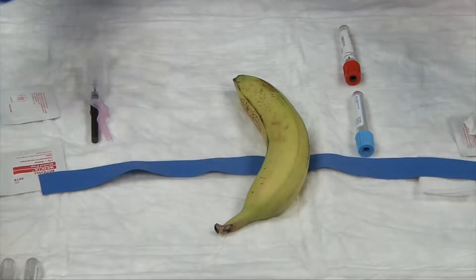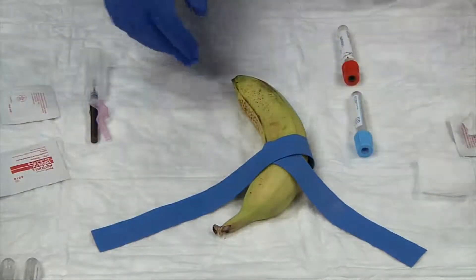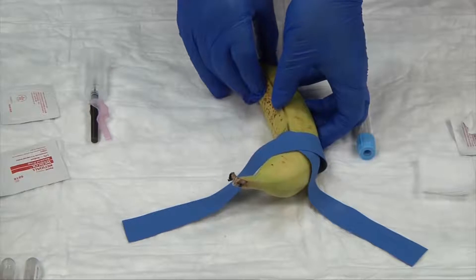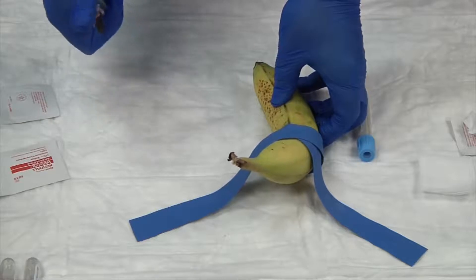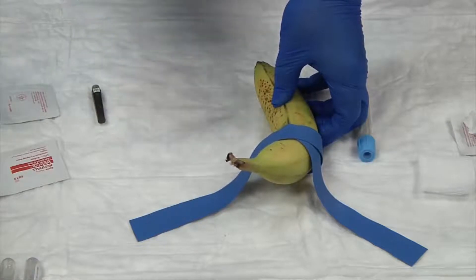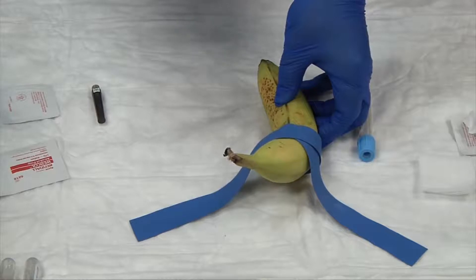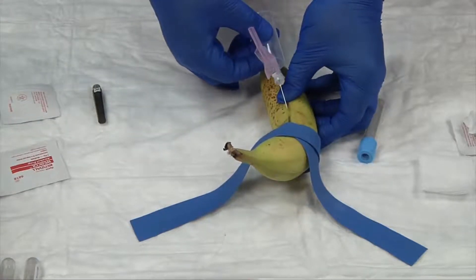The alcohol is already dry on our patient. Let's go ahead and place the tourniquet back on. With my non-dominant hand, I'm going to anchor the vein — take your thumb, gently press down, and pull back a little to pull the skin tight. With my dominant hand, I take the needle, release the cap, and check for any barbs or shards — anything out of the ordinary. I hold my needle with the safety cap pulled back, my thumb on top and two index fingers below, and I stick. One, two, stick.